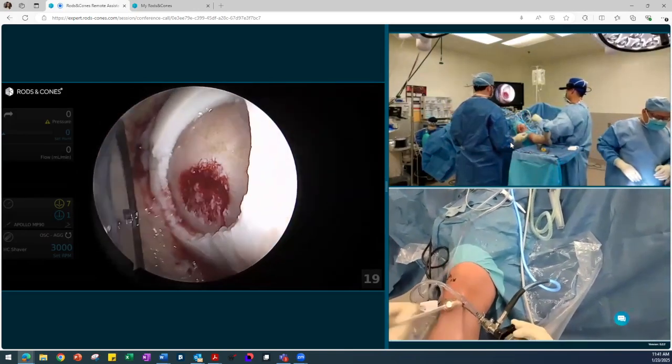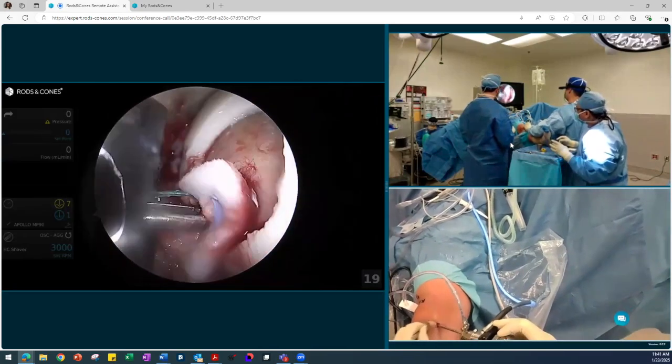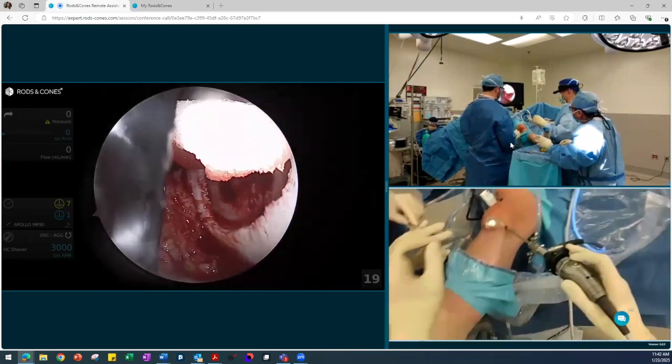The tourniquet is now down. You can see there's bleeding at one part of the defect. We're going to start off with epinephrine pads. These are similar to spine surgery. And then what we're going to do is focus on gel thrombin. So the gel thrombin is going to go in there.